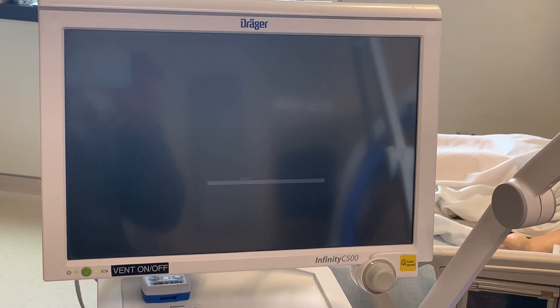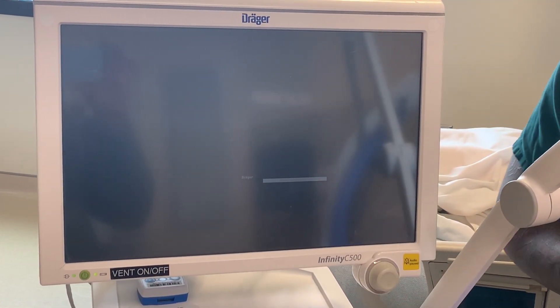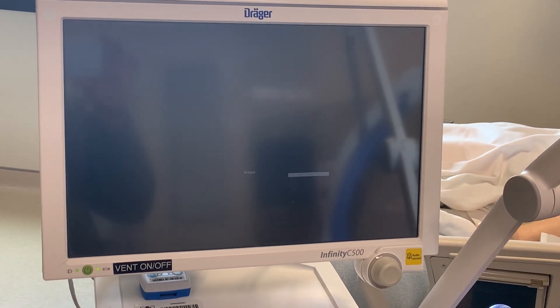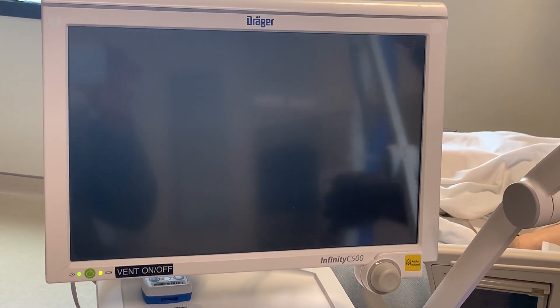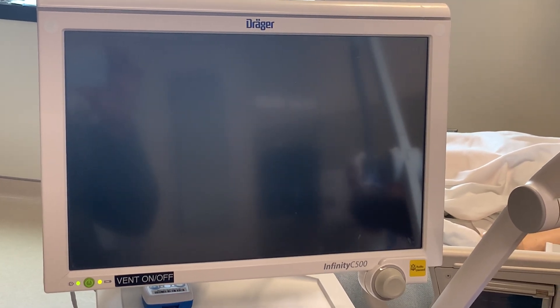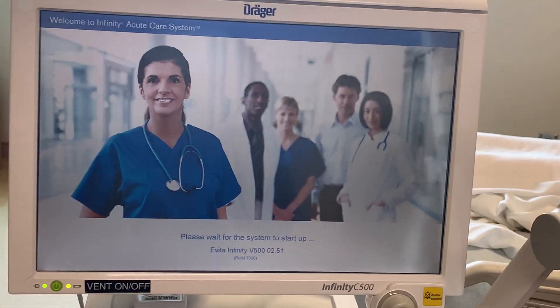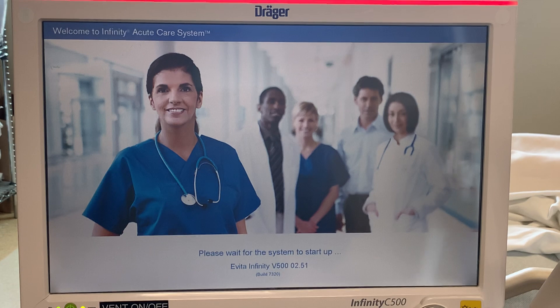I'm going to hit the power button and give the ventilator a second to do its pre-use check.